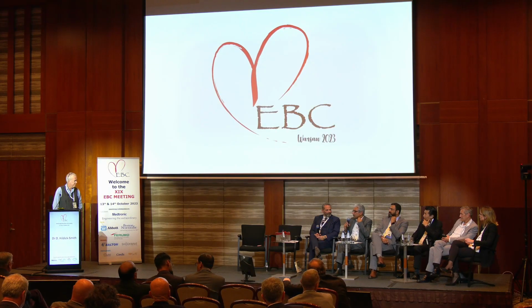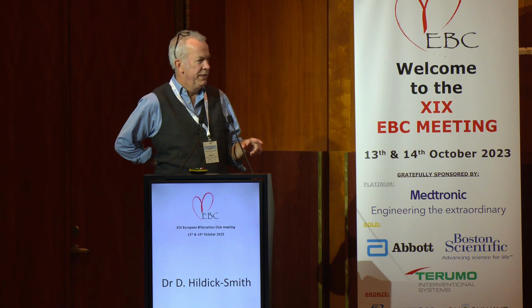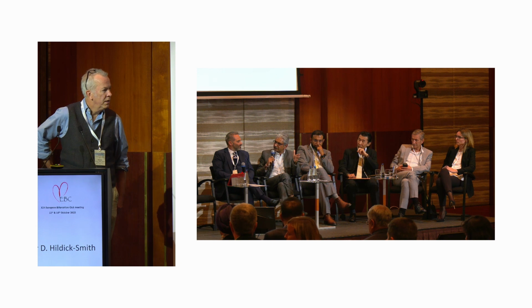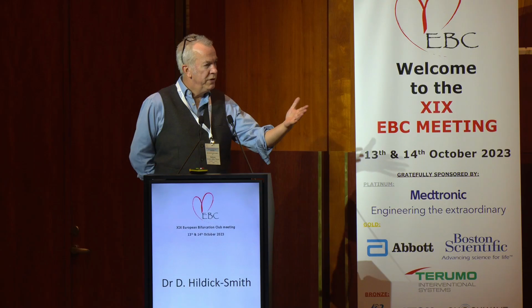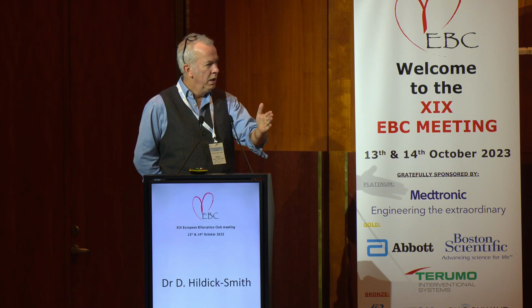Great, David, thank you. Fantastic proposal. So in inclusion criteria, you said 111. Is there any criteria for side branch disease? Like it should be complex, because you will be doing T-stenting in the other group. So it should be more than 10 millimeter, less than 10 millimeter. We can finesse that. It may be that we choose less than 10 millimeters. Maybe. And is there an option of not doing T in the other arm? T-stent? No, it's provisional. It's provisional or T? Mandatory kissing because it's 111. And then T if required. T if necessary, rarely.